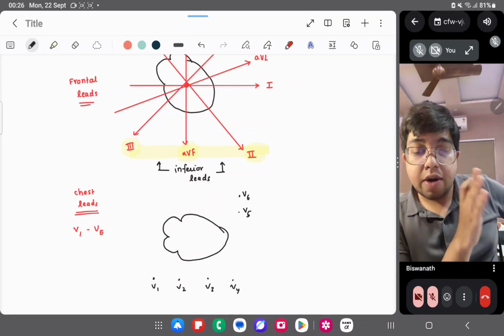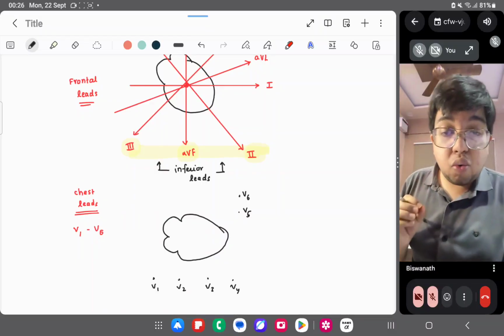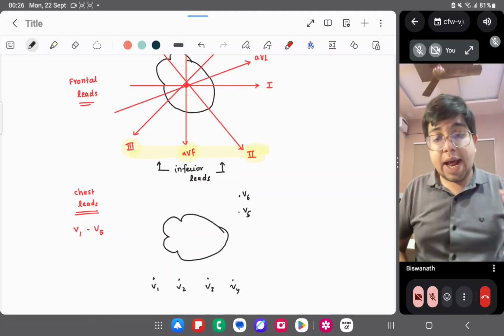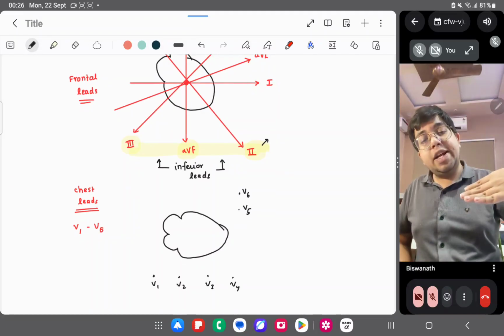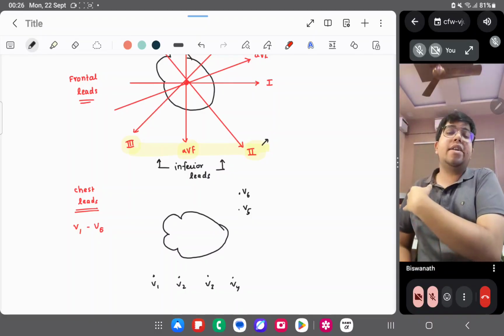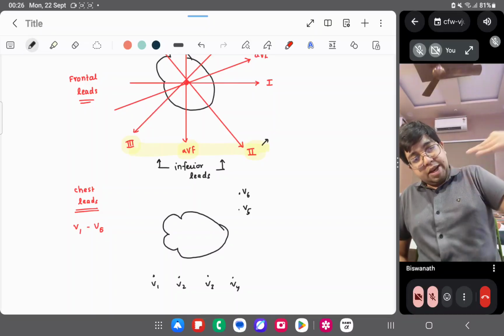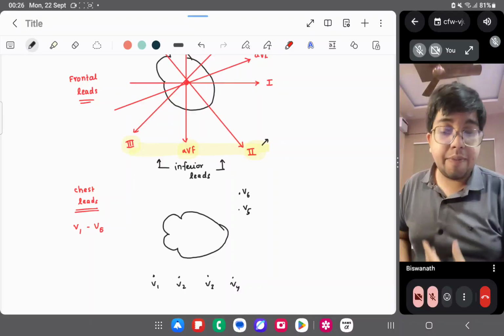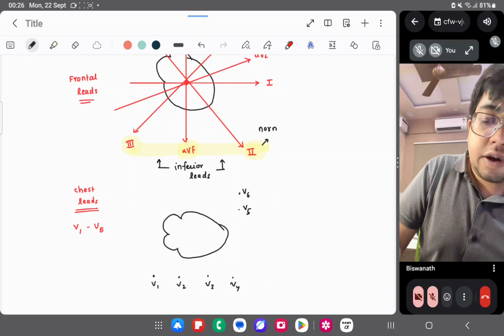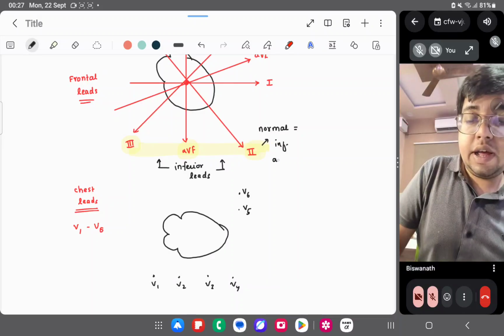And the normal electrical vector, or you can say the direction of lead number 2, is basically inferior, lateral, anterior. What I'm telling is that it is going inferiorly, laterally, and anteriorly. If I'm looking, it is coming towards me, down and laterally, and anteriorly even.